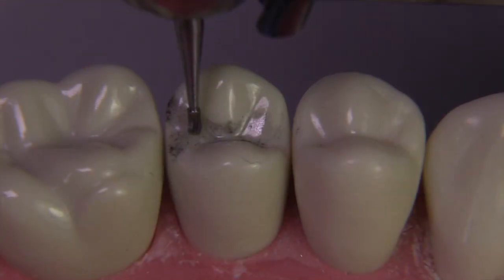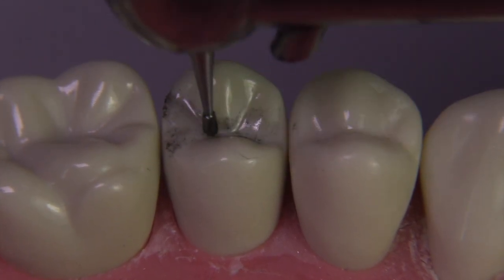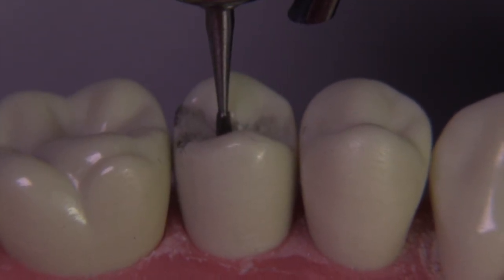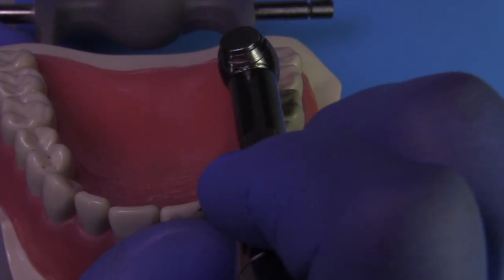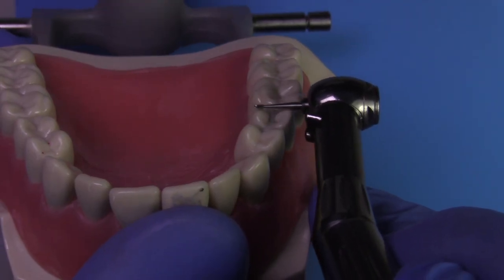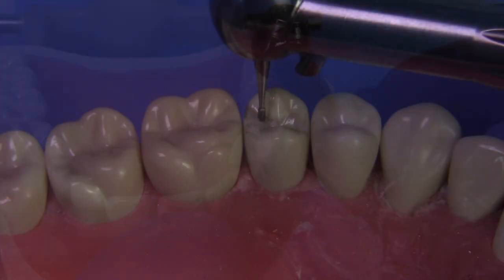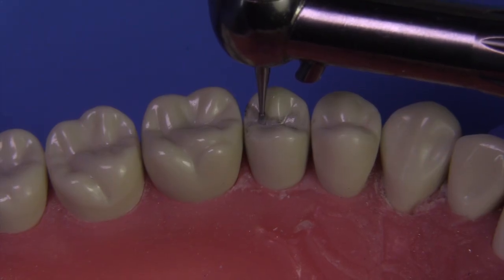We're going to utilize the 330 burr as we always do. I like to make sure that I'm holding the handpiece in the right orientation, buccal-lingually and mesial-distally, before I start the preparation. You can look at it from the facial and make sure that you're not tipping the burr lingually or facially. Perpendicular to the occlusal table is really the go-to position. Lock your finger rest and the handpiece will do the right thing.